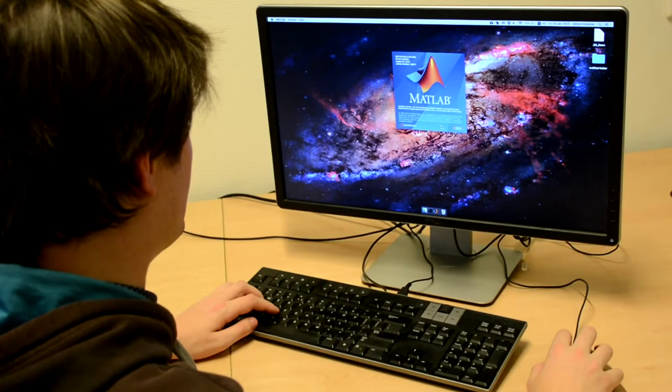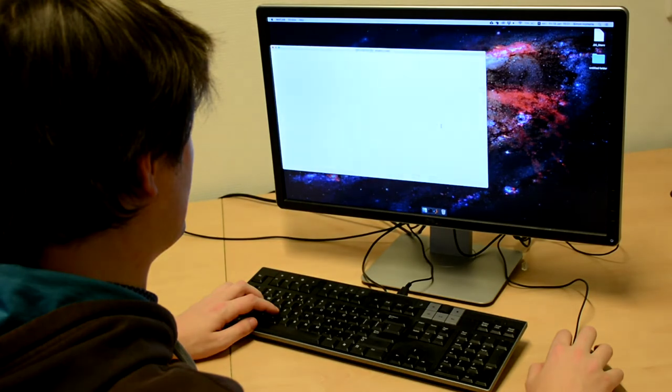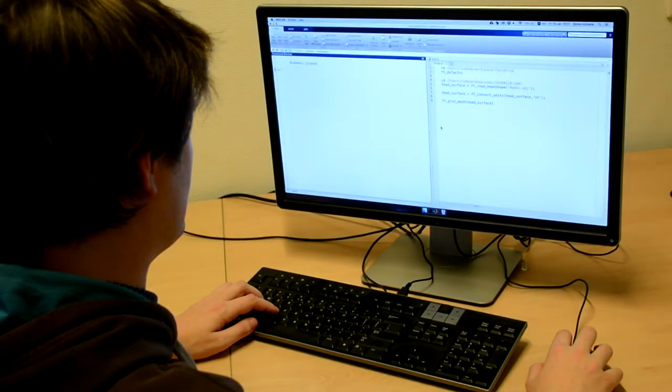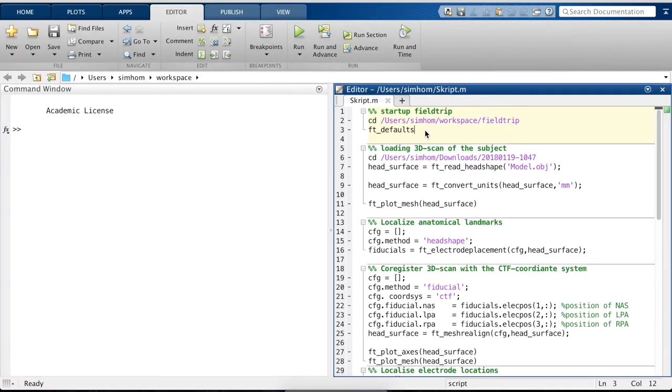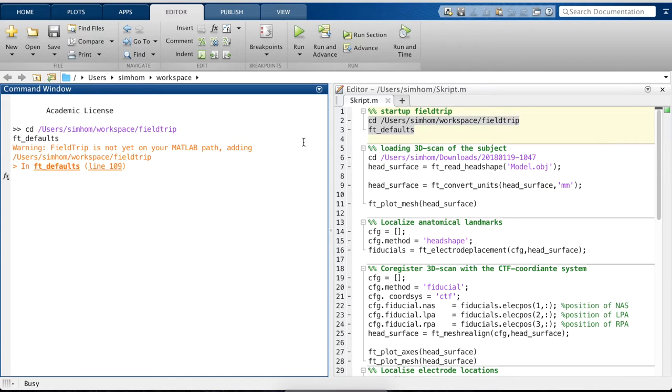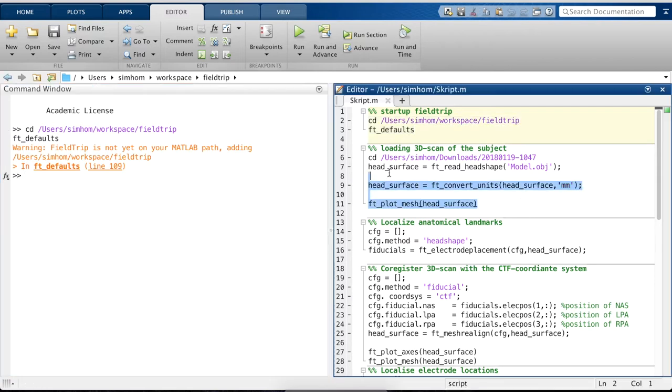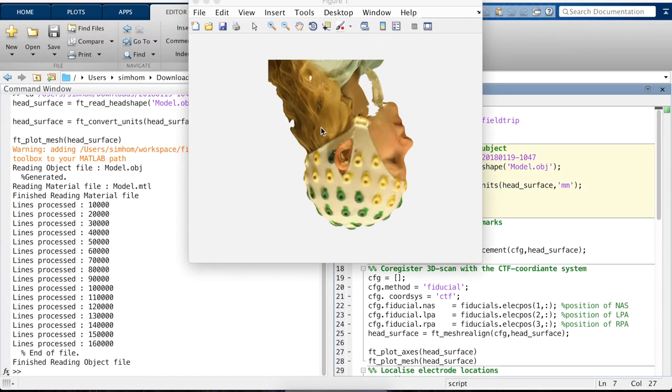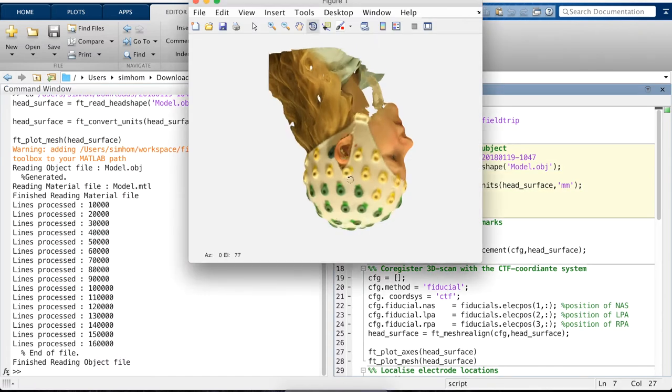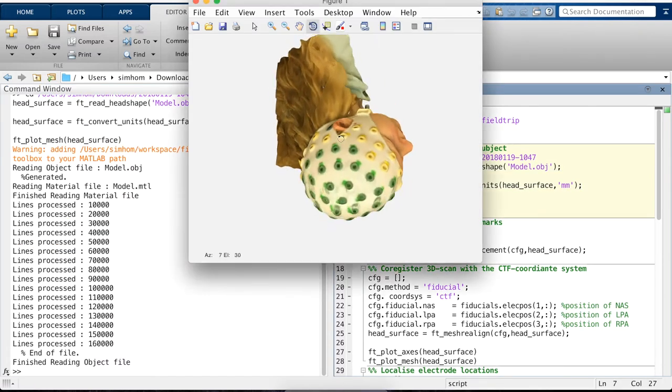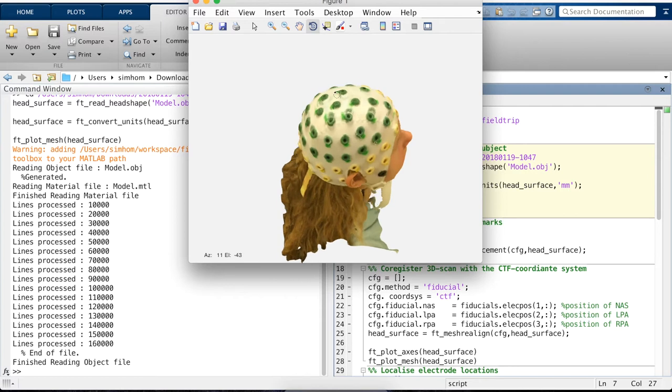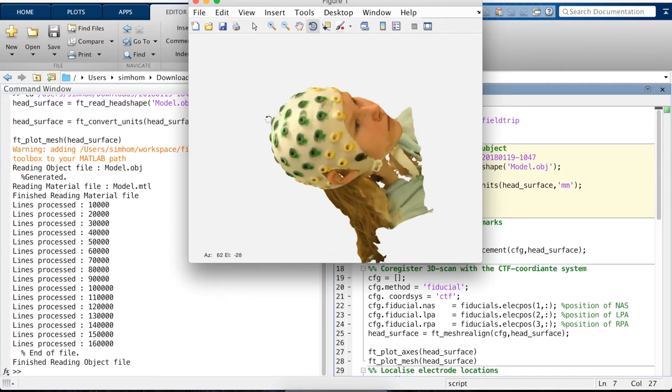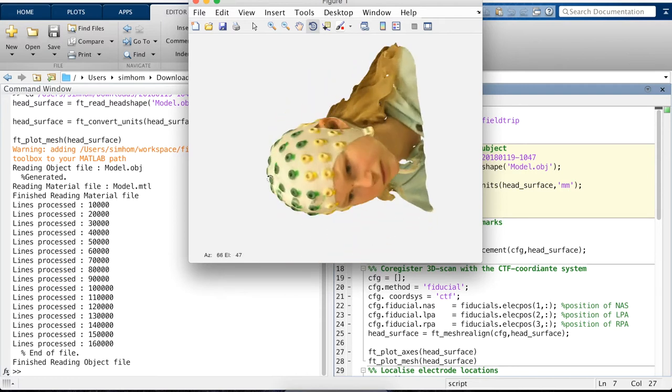So we start with MATLAB. And with MATLAB, we firstly add Fieldtrip to our working path. And then we load the Structure I.O. model. Just like this. Then we can rotate again to see this is the same dataset as we saw in the previous part of this video.